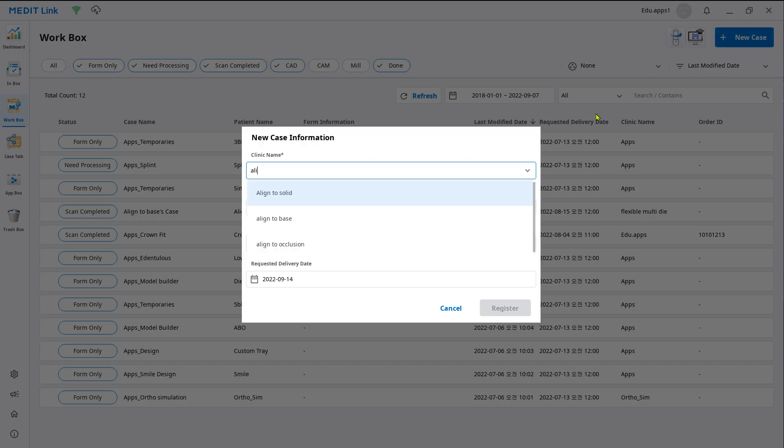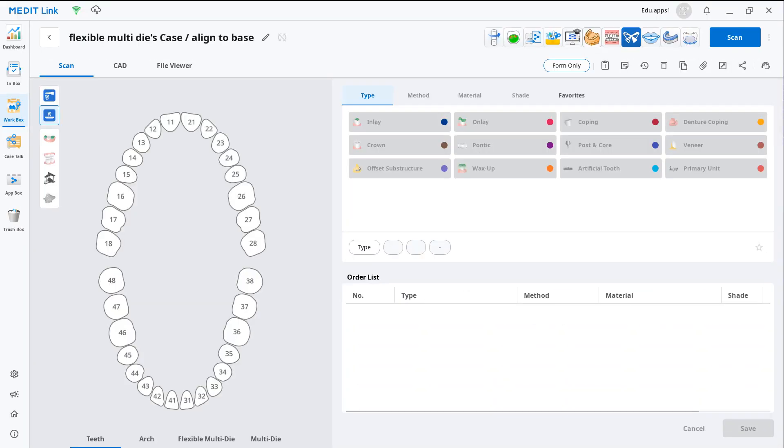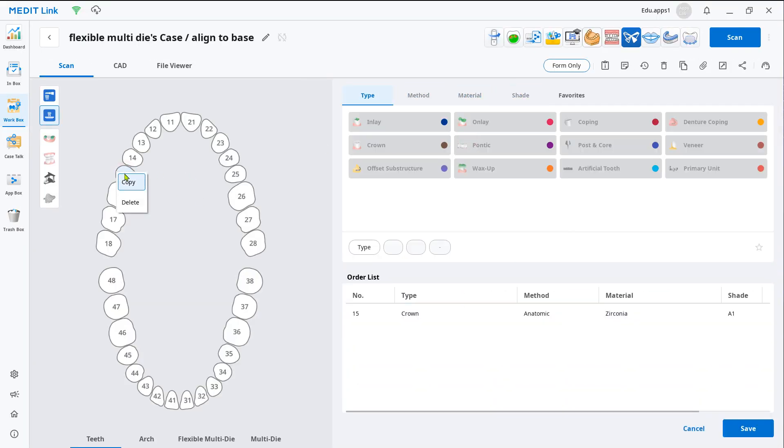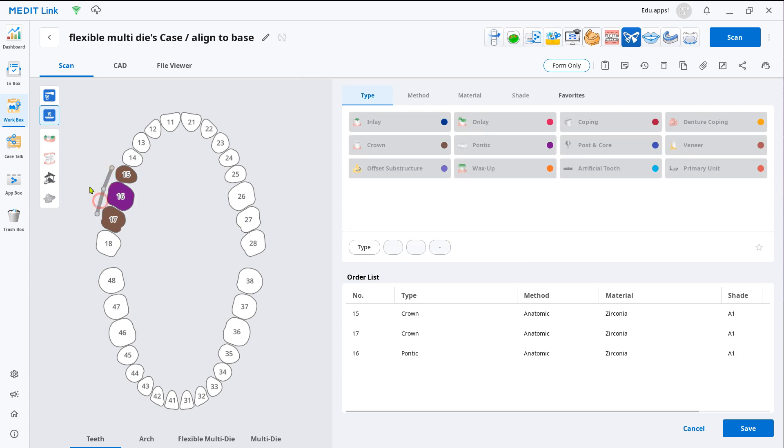Create a new case in the workbox. Enter the clinic and patient's name. In the case detail window, select the restoration information according to your work and click scan.